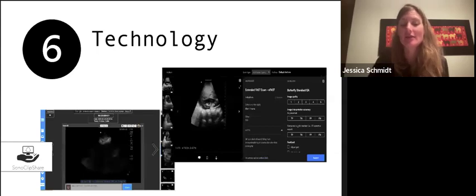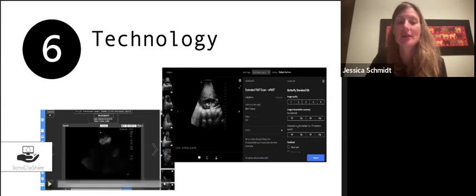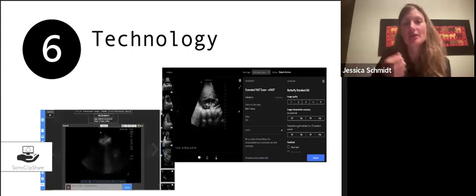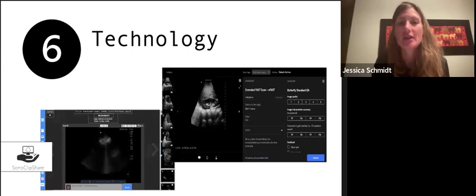And then there's some other things that are on the internet and really free, like Sono Clip Share, which was invented by Ben Schmidt. This is a really neat program where you can upload your cases, and then we can even comment back and forth. So in Uganda, that's what we used at the beginning. We used a USB drive where we took our images off the machine, we put them onto Sono Clip Share, and then we were able to develop our ultrasound portfolios like that and share comments back and forth about the images and quality.